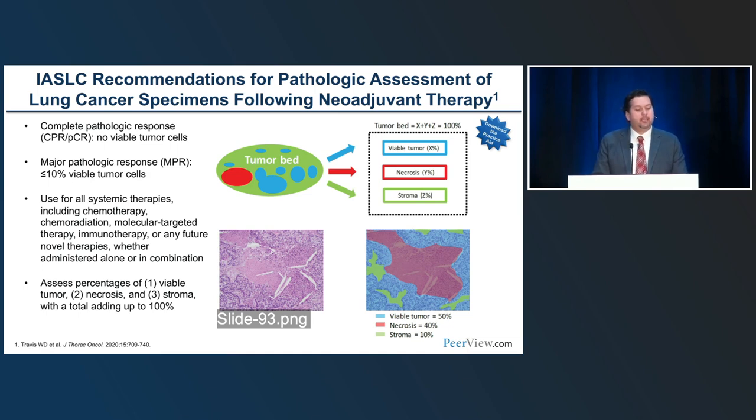And to date, again, we report this with 10% increments. There is a call to score very small increments as single digits, but in general, we score it using 10% increments, and it's semi-quantitative. So it's not quantitative, it's an estimation, but really depends on how the tissue was mapped.